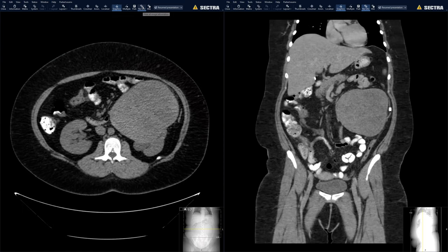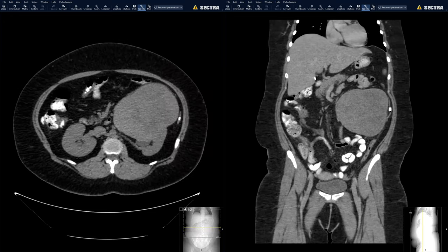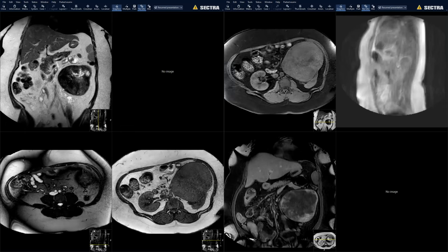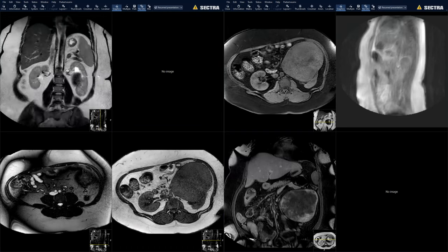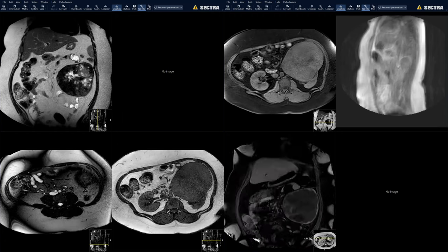I think it's going to be something benign. That is exactly what I think too. But my question was, would you even give papillary as a differential in this? Yeah, I think you have to, because papillary can be really dark and can be large, and it's much more common than a rare thing. Right. And the other thing we read about papillary was that once it becomes larger than 4 centimeters, it can get very heterogeneous. So it could be that.